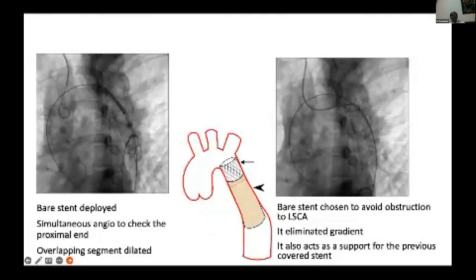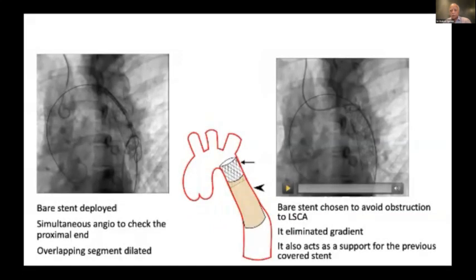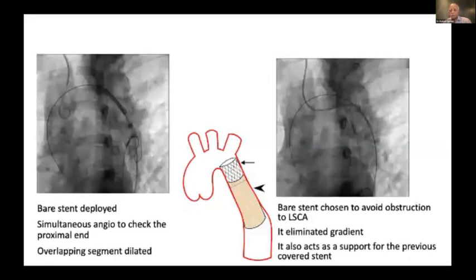Dr. Shak, Worakan, Peter, any points? And then yeah, so years ago I had one stent embolized, migrated really is the right word, upwards, so proximally, and did pretty much exactly what you showed. And we immediately put another balloon inside and pulled it down into position. And there and then, if you recognize it, it's much easier to do it that way. What you've done is you've achieved it.